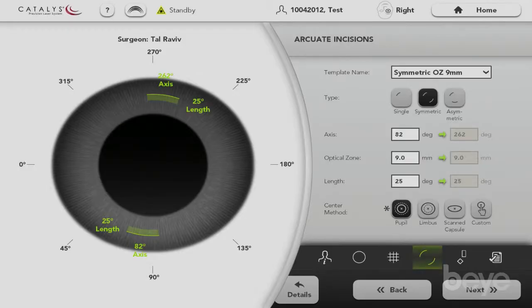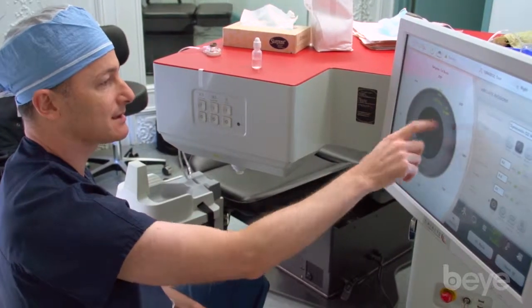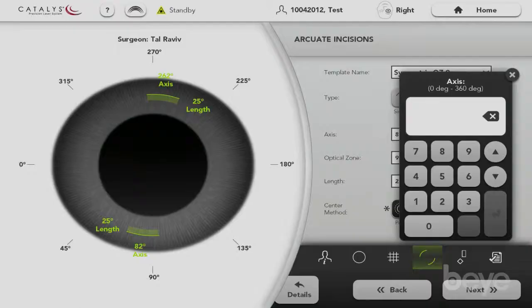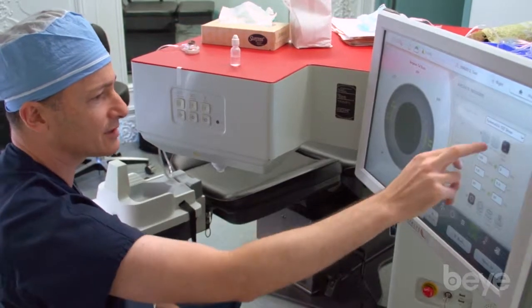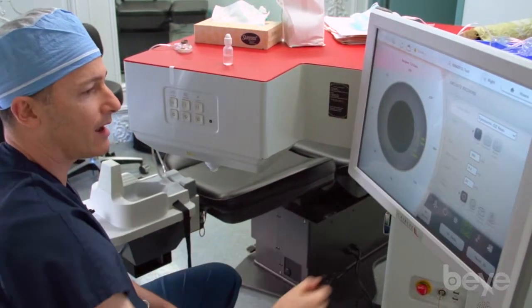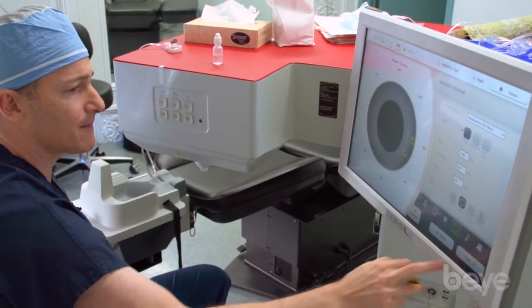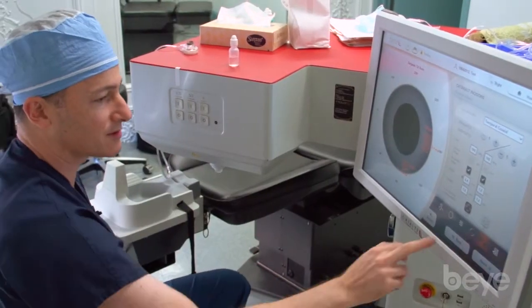Arcuate incisions are also very accurate with the femtosecond laser — far more so than we can apply by hand. We can program the axis, the optical zone, and the length. You can simply change the axis by changing the number and everything moves. We can do single, double, or even eccentric astigmatic keratotomies. Usually these are on the limbus and easy to program. Finally, you can program your main incisions as well as your side port incisions.